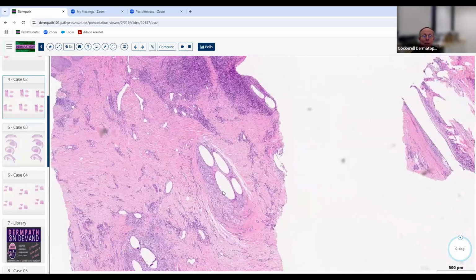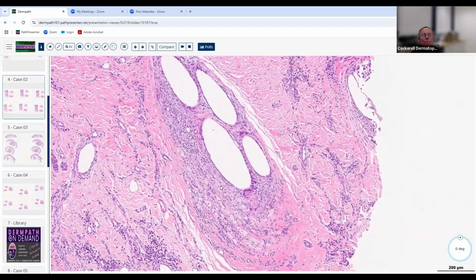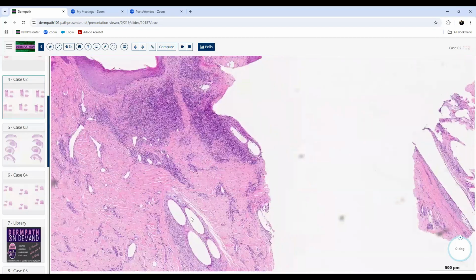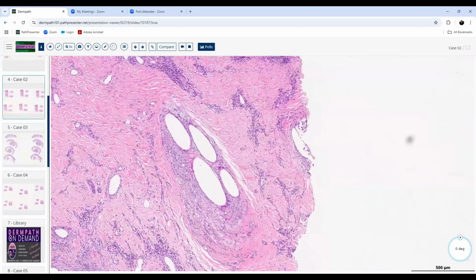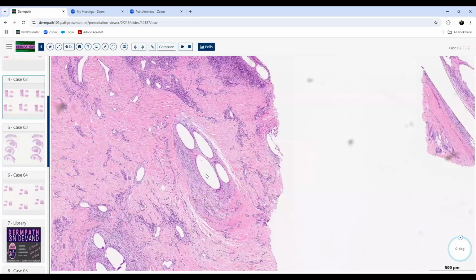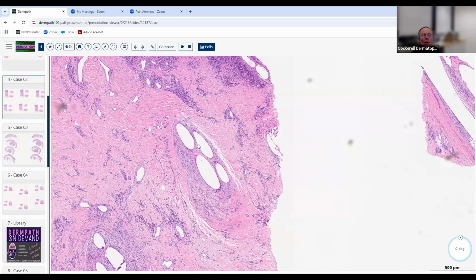Okay, we're going to higher magnification. And now what do we see? What's going on here, for example? Also some neutrophils and then maybe a few EOs in there. There's some histiocytes here, but what's this right here? What do you think happened right there? Oh, so multiple hairs in one hair follicle, like polytrichia. Yes. There's no residual hair follicle here at all, basically. Everything is destroyed. These are the ghosts of 4 little hair follicles that were once going on there.